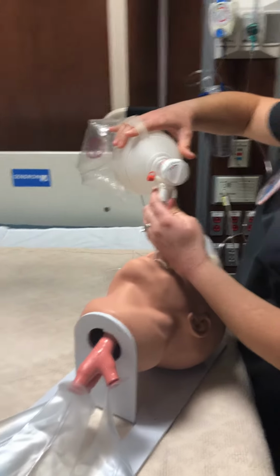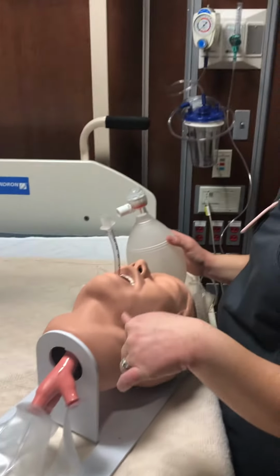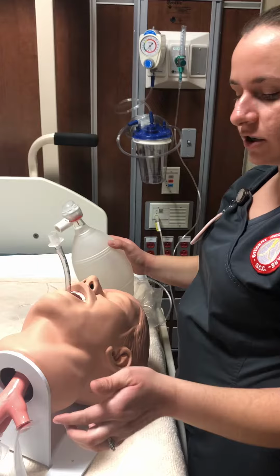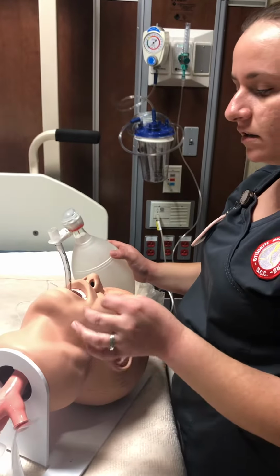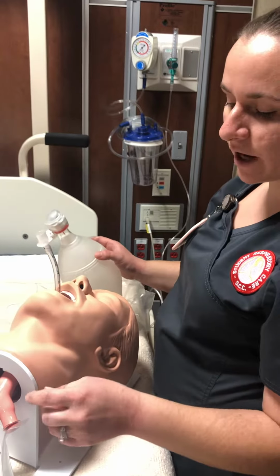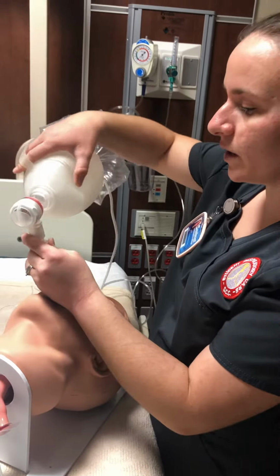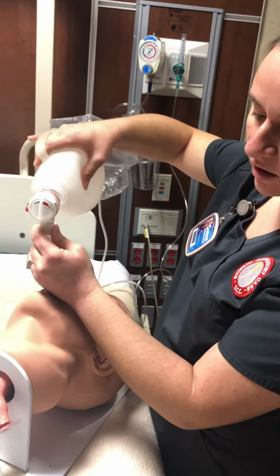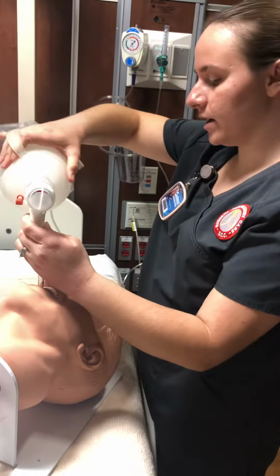And if I notice that only one side of the patient's chest is rising, I need to check the tube. So I need to auscultate to make sure that the tube is in the proper placement. And if for some reason it is too far, I have to be very careful and move it back just a little bit. Then once it is ready, I can go ahead and do the breath and check again to make sure it is getting the proper oxygen to both the lungs.